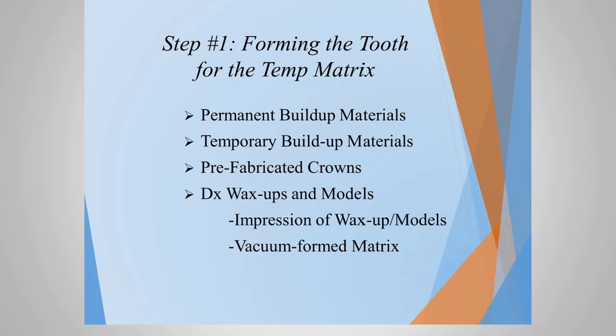Step 1, forming the tooth for the temp matrix. There are a lot of ways to do this. Most of us use permanent build-up materials, especially with teeth that are endodontically treated, where we're placing either some type of core material or some type of post.